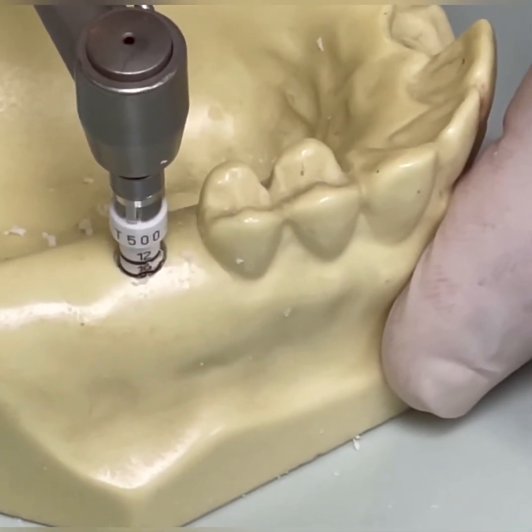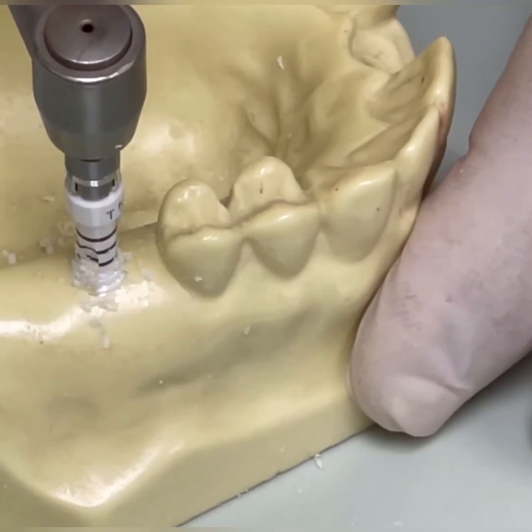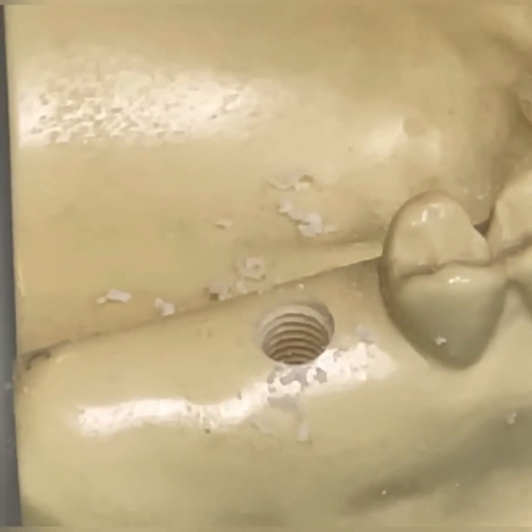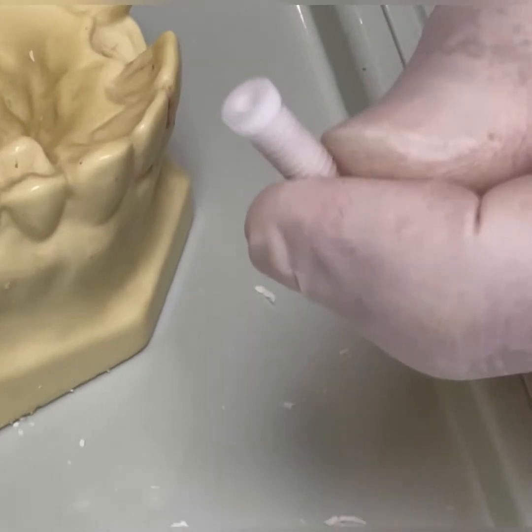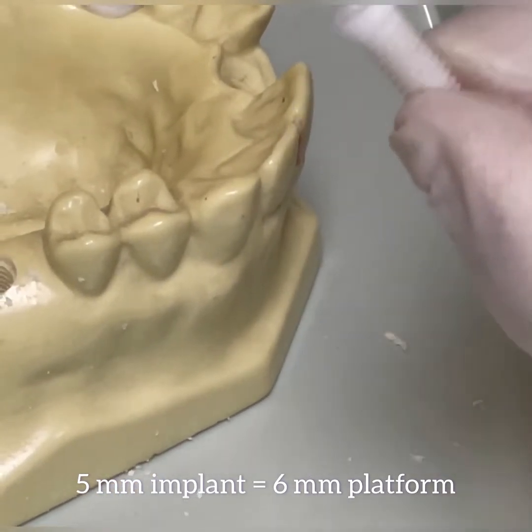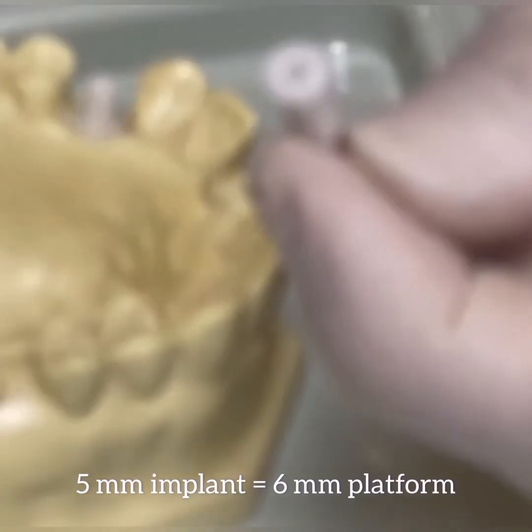We are at 12 millimeters, so now we're going to reverse it — it's like a truck reversing. Now we have the internal threads, which we can easily see. At this stage we're going to irrigate with saline — definitely irrigate to get all the debris out. For the tissue level implant, there is a little tulip or platform that's wider. The platform is usually six millimeters in total diameter, whereas the implant is five millimeters in diameter, so you have to plan ahead when placing implants in confined spaces.